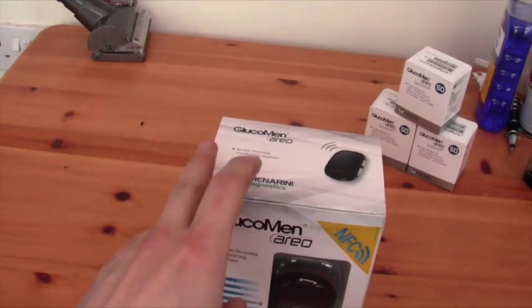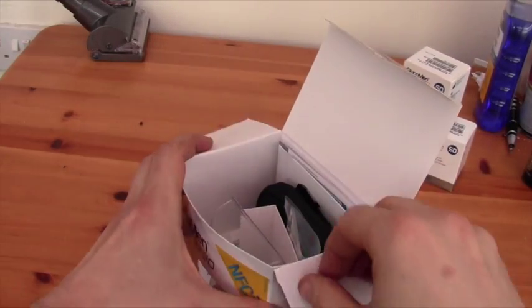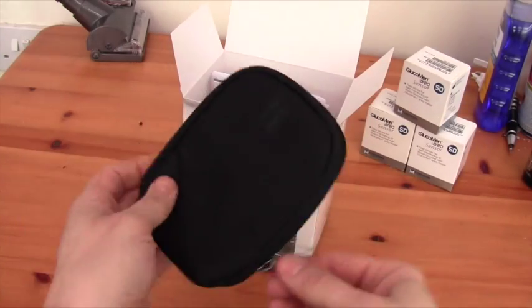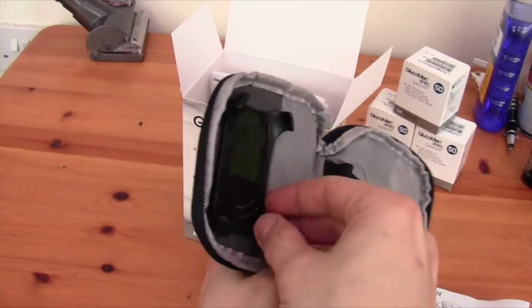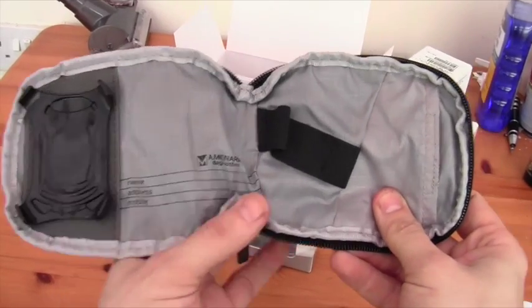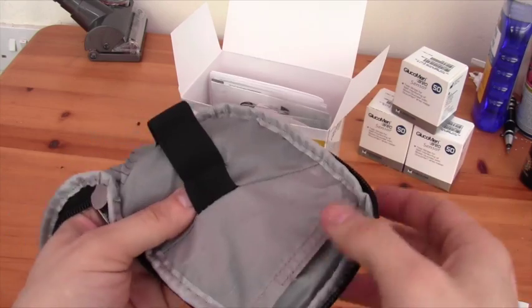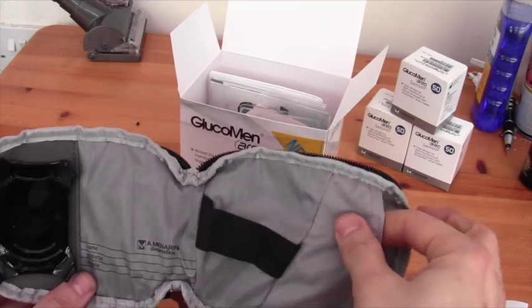Let's move on to taking a look in the box. There's a transportation case for it, which if we open up is actually quite well laid out. There's a plastic clip here for the meter to go into, space to write your name, address and mobile number. The other test strips pot can go in there.